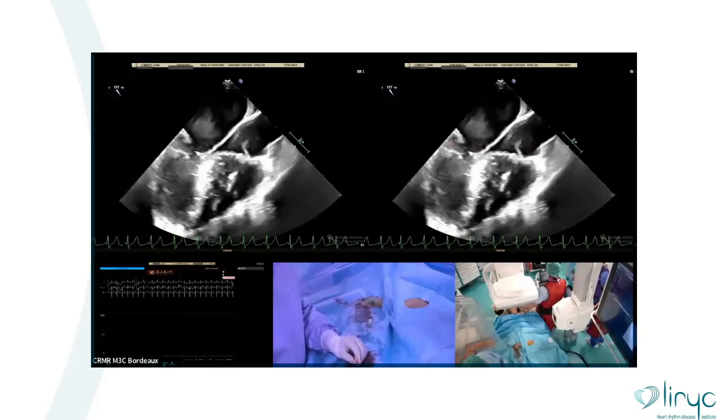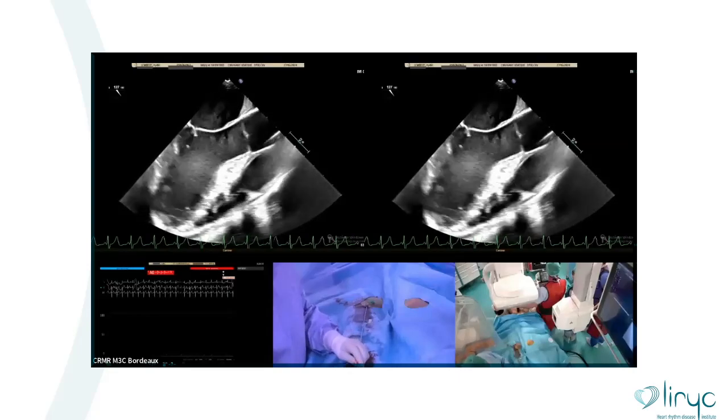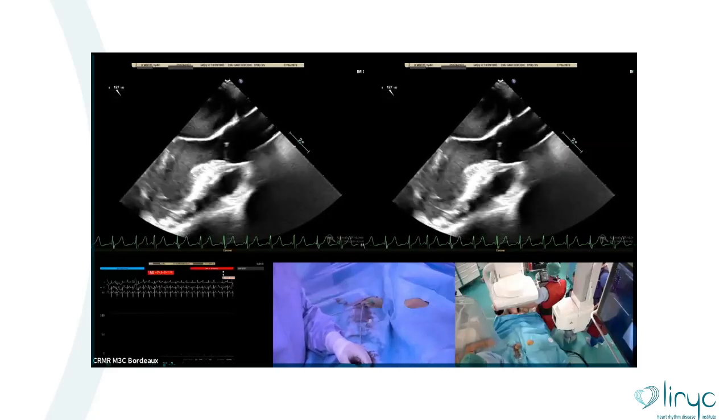Okay. Yeah, I see your guide in contact with the aortic valve. I think so. Okay, ça c'est mon cathéter.